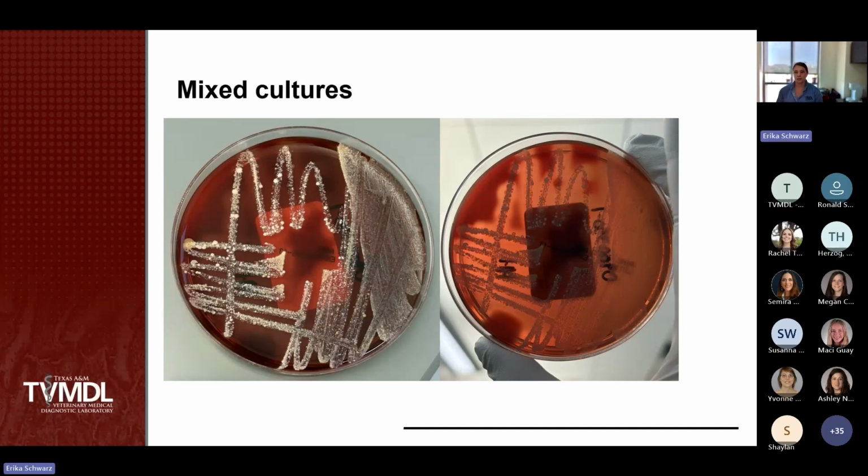We'll work on this over the next couple of days. We'll make subcultures and try to isolate and identify the different organisms present. But every time we sub out a colony, we're waiting about 12 to 24 hours in most cases until new growth on a plate becomes apparent. And sometimes with a particularly dirty culture, we might have to make subs of our subs.